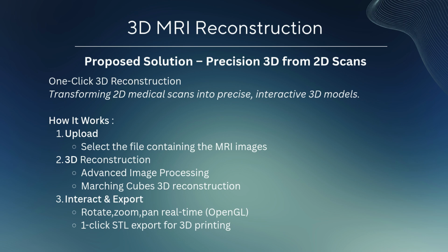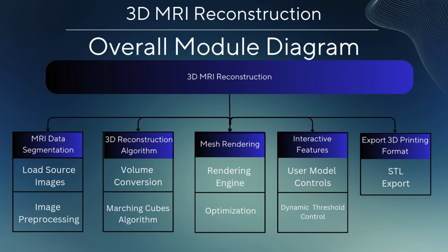also patient education. Okay, let me walk you through the overall architecture of my 3D MRI reconstruction system as represented in this module diagram. At the core of the system is the main objective, 3D MRI reconstruction.